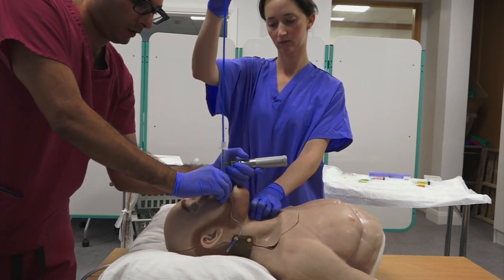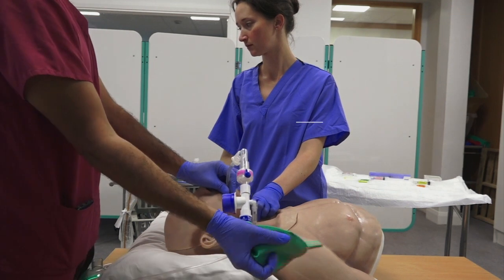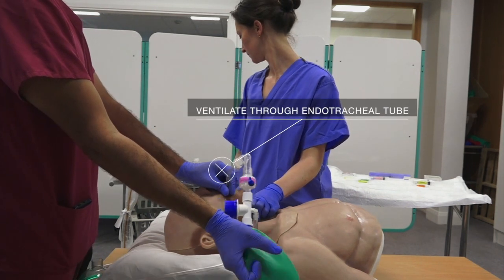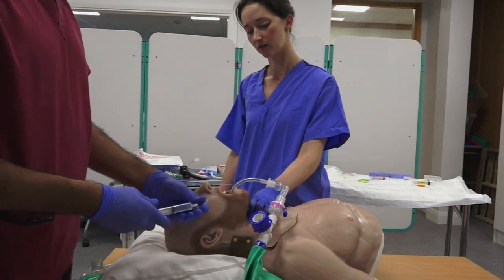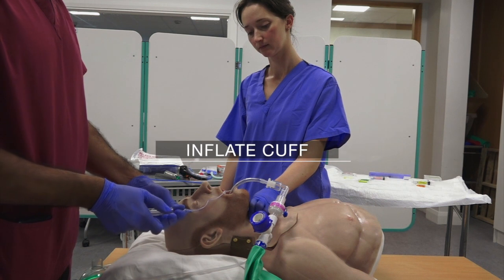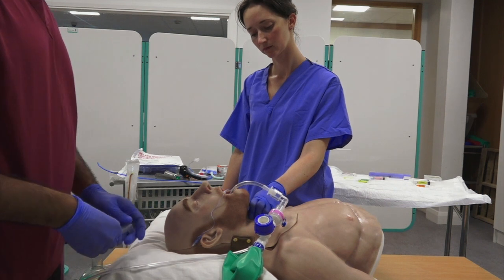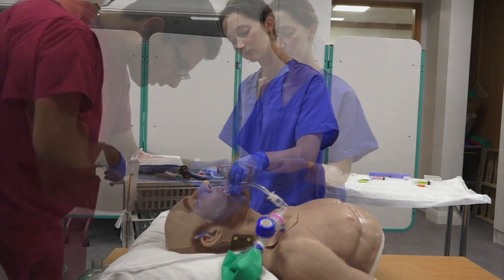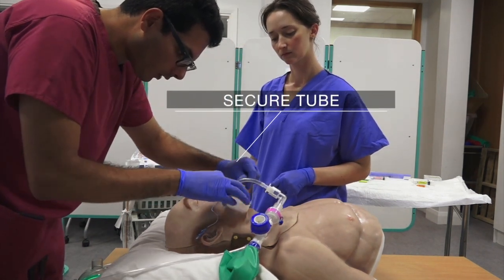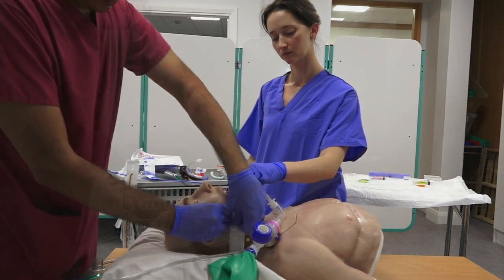As the tube is railroaded over the bougie, it is rotated clockwise or counterclockwise to allow the bevel to pass above the arytenoids. Once the tube goes through the cords, the bougie is removed and ventilation is provided through the tube. The cuff of the endotracheal tube is inflated to create a seal. Cricoid pressure is released once an adequate seal is maintained. The tube is then secured with a fastener designed for use in the intensive care unit, and a mechanical ventilator can now be attached.